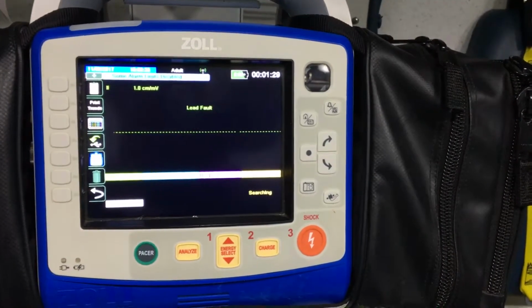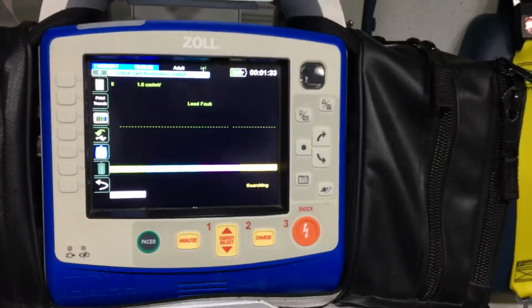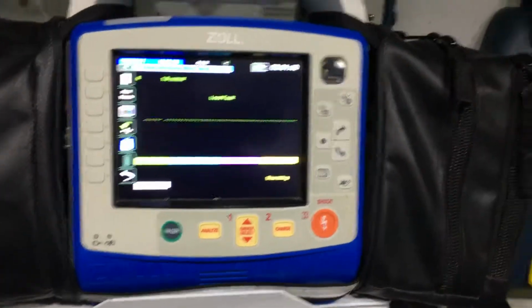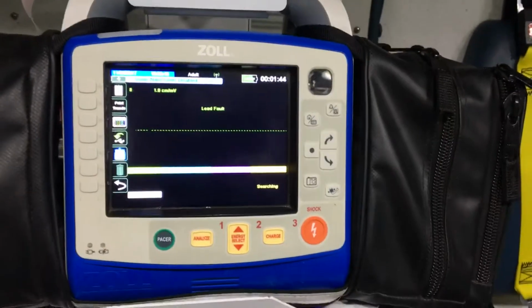and once it brings it in, there'll be one last button to push. It'll say import now or something like that. You hit that, and it'll take it to your vitals section. Like I said earlier, if you need to change something in it, you can edit your numbers.